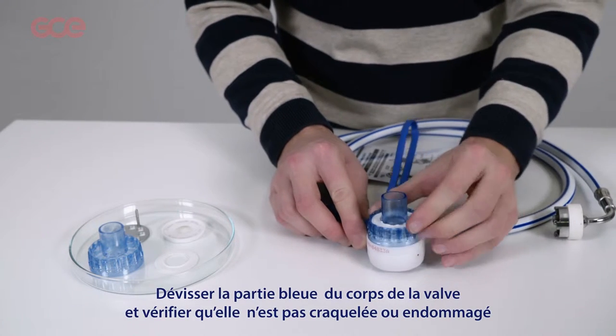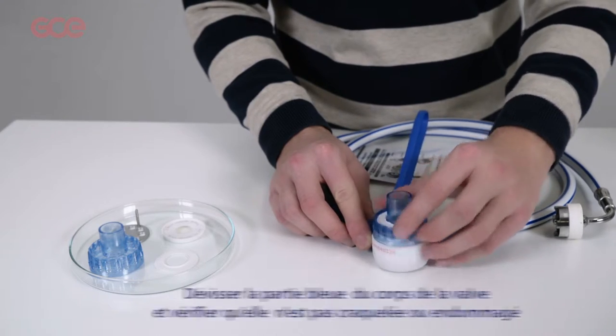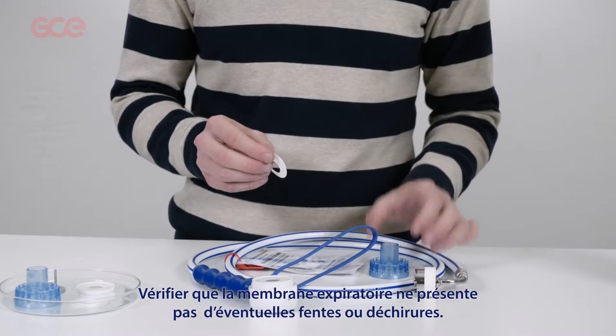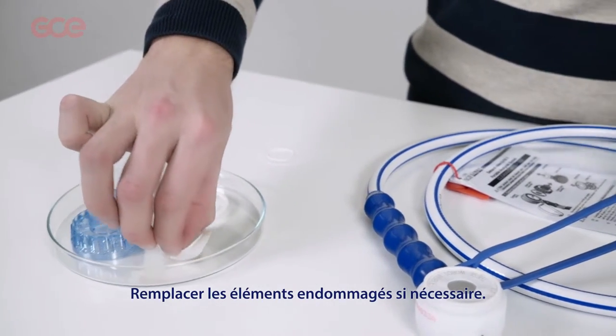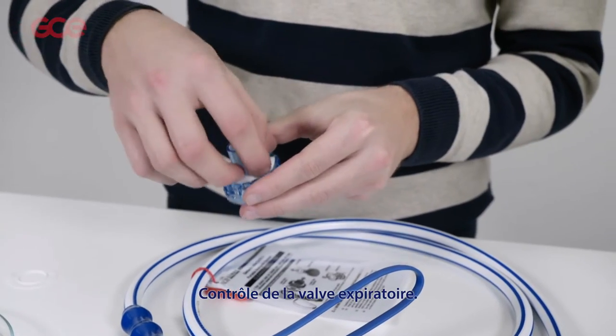Unscrew the blue part from the main valve body and check for cracks or damage. Check the exhale valve flap for tears and splits. Replace the parts if necessary. Refit the exhale valve flap to the patient port.